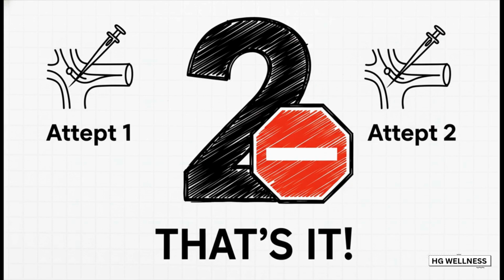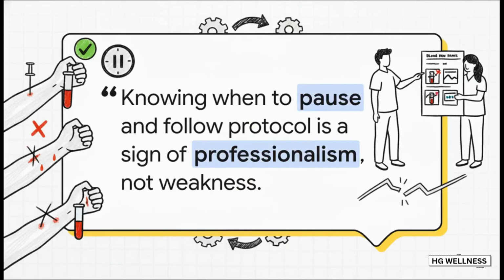You get 2 tries. That's it. And let's be super clear here. Stopping after 2 attempts is not a failure. It is the definition of professionalism. It means you're prioritizing the patient's safety and the integrity of the sample over your own pride.